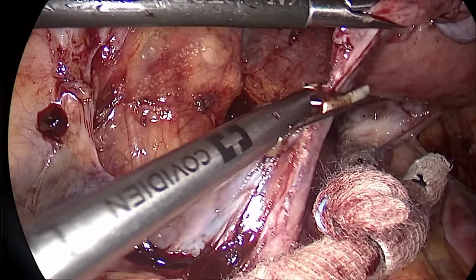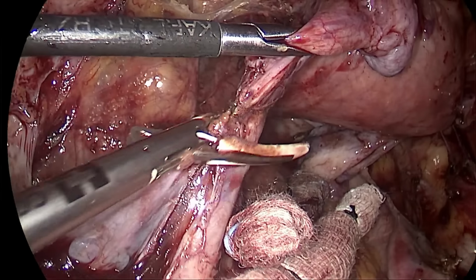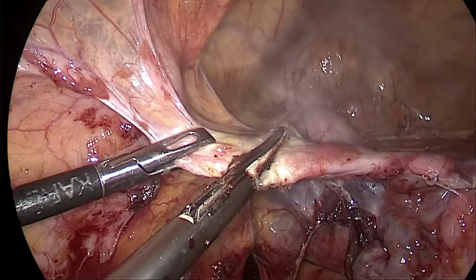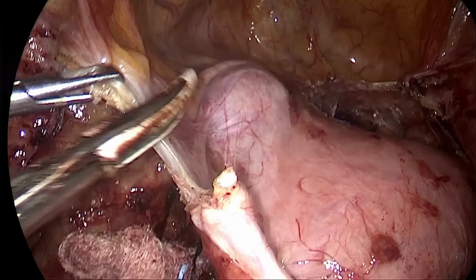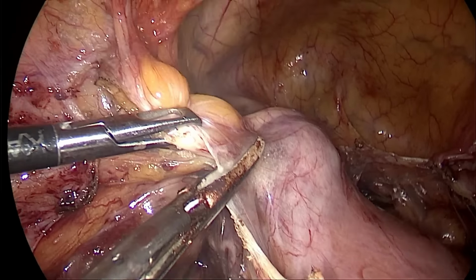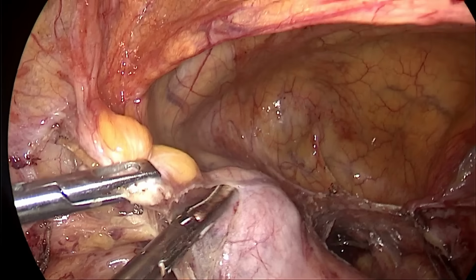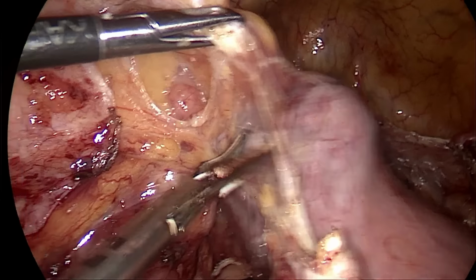So once we have identified our ureter, I am taking the left-sided infundibulopelvic ligament. So once that is done, we are moving anteriorly in the bladder flap. So in this case, there is a small fibroid in the lower segment, a low anterior fibroid, and the bladder was adherent. So we have to move gently so that we will not injure the bladder.